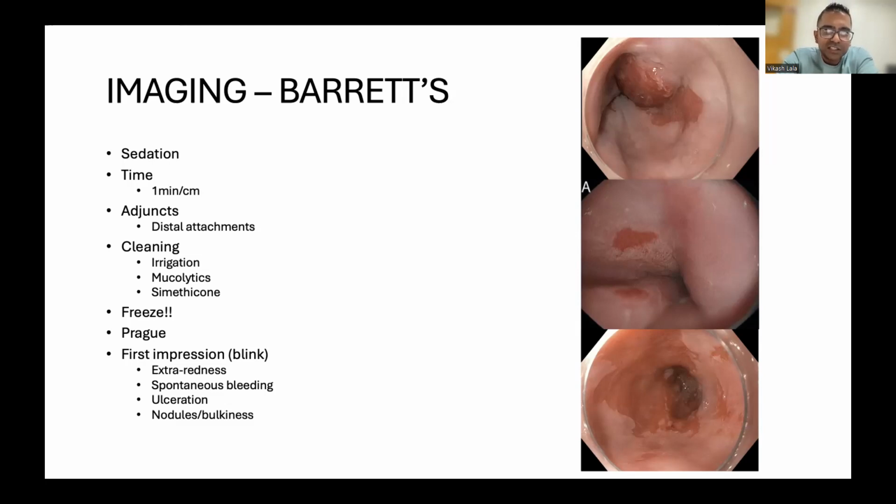Remember the Prague classification when we were dealing with Barrett's? I think most people will be familiar with regards to circumferential and maximal distances, and as well when you have hiatus hernias, because that can become a little bit tricky. So what you want to do when you're looking at the Barrett's segment is first step back. What I mean by step back is, just get off the lesion, as you can see in this last picture, and freeze your image. Just step back and look for things that stand out to you.